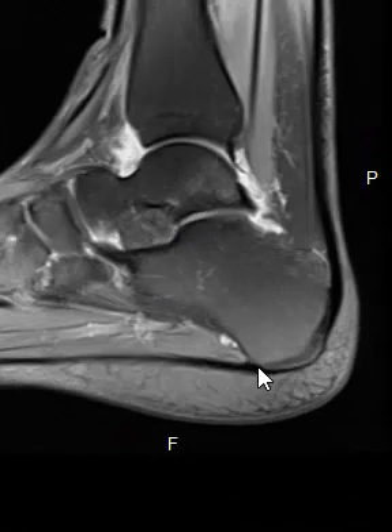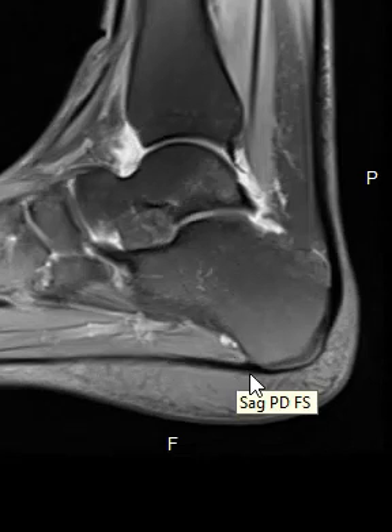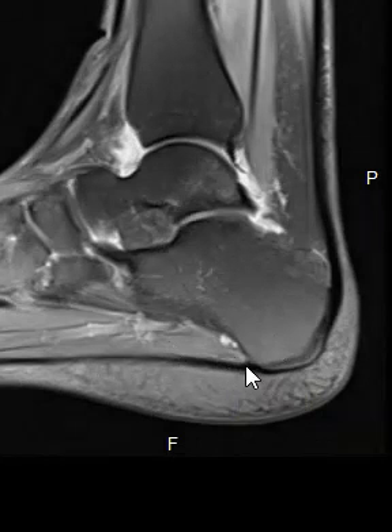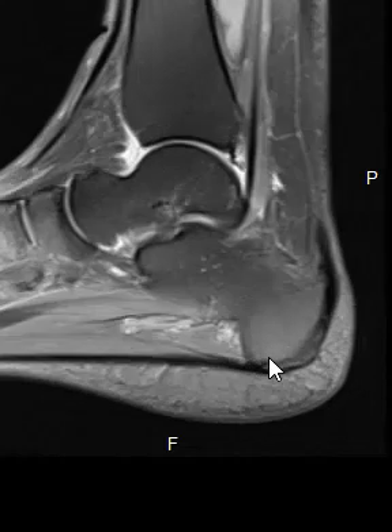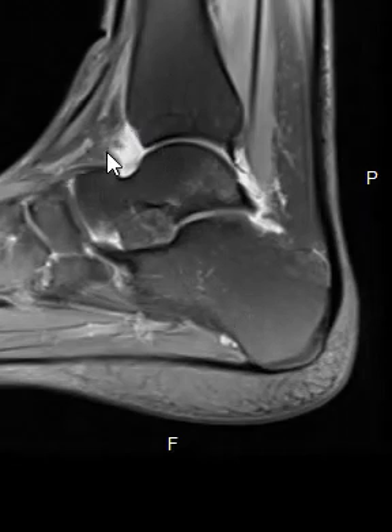Along the undersurface we see another thing — a linear band. This is called the plantar fascia, and it looks great. Sometimes it can be partially torn, thickened, or inflamed; sometimes you have heel spurs down here. Luckily this one looks very, very good. Up here is the ankle joint — this is the tibia and talus that make up the ankle joint.